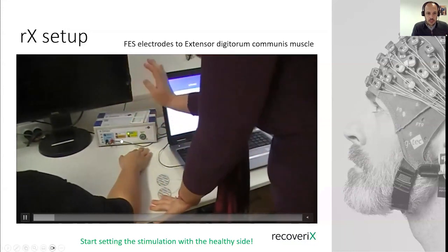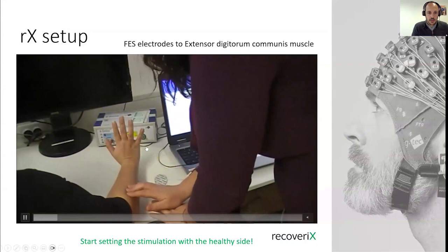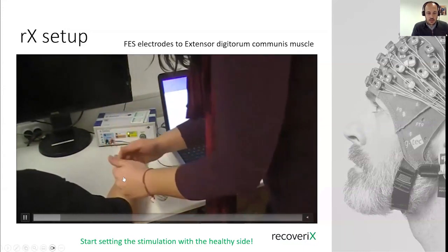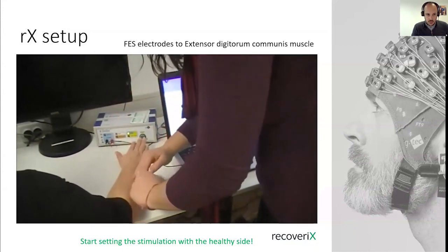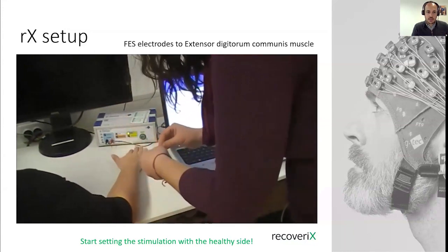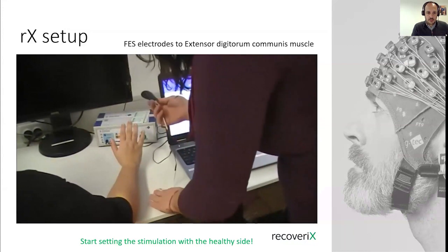These electrodes, as I said, are connected to the functional electrical stimulator. Here the therapist is asking the patient, on the healthy side, to do the wrist dorsiflexion. She's trying to locate the muscle belly. Seems that she found it.